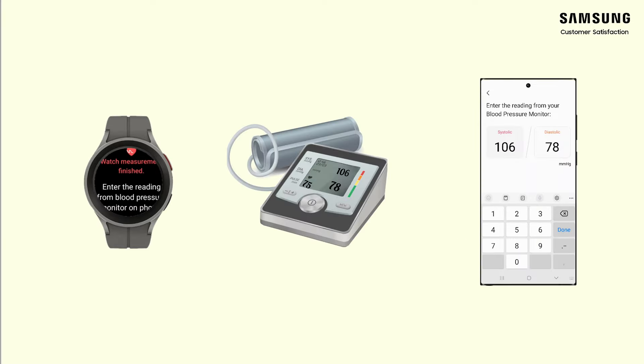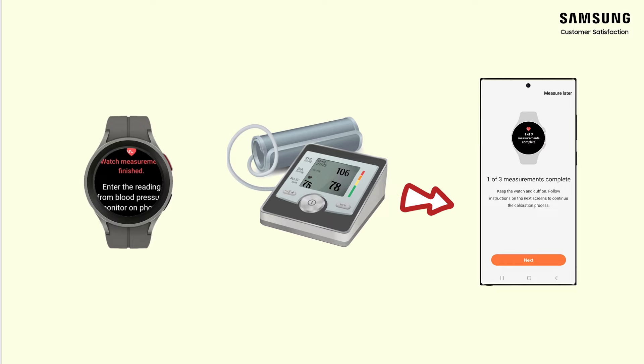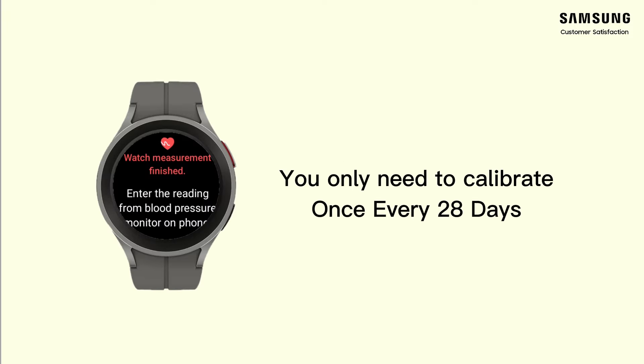Your measurement is finished. Enter the reading from the blood pressure monitor on the phone. For better accuracy, measure three times. You only need to calibrate once every 28 days.